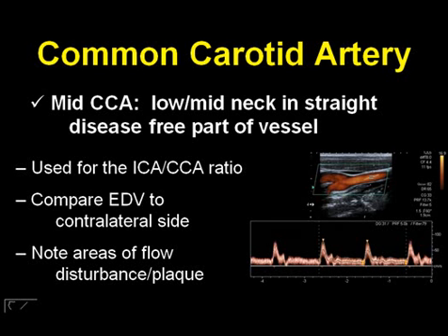Another reminder is that we should be evaluating the whole length of the carotid artery system using all the tools in your toolbox, and we always use color. In the old days, before we had color, we had to take that sample volume and step it through and move that sample volume up and down and back and forth within the carotid artery system. However, one of the advantages of color flow imaging is that it allows you to see a wide field of view. And what we do is we allow the color flow image to tell us where we need to stop within those areas of those predetermined sites for evaluation.